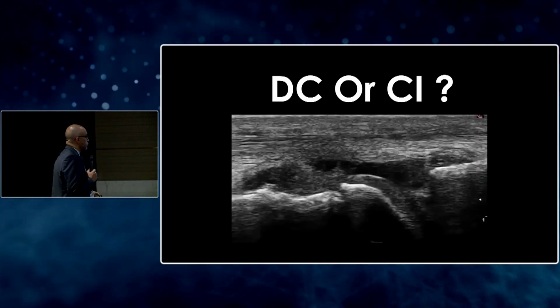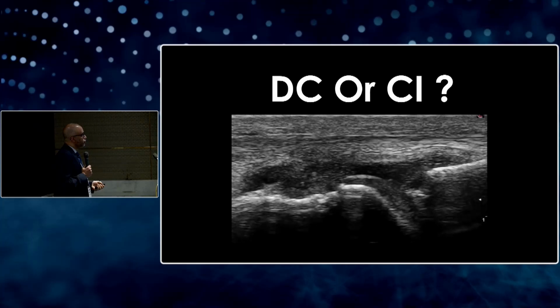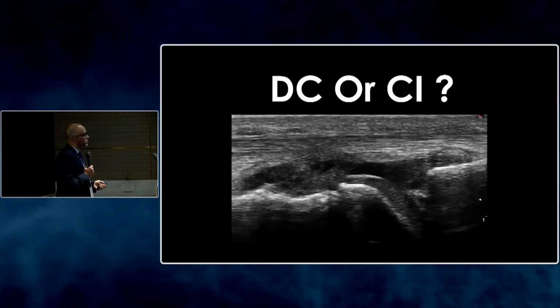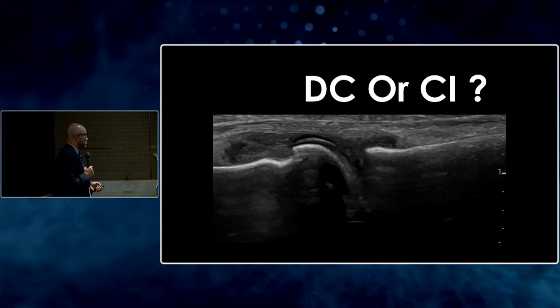Okay, so describe here, this is a signal typically at the middle of the screen, and you can see by changing the probe orientation, I miss the signal at some points. Yes, there is some synovitis around, but this is actually a false signal of double contour, a cartilage interface.